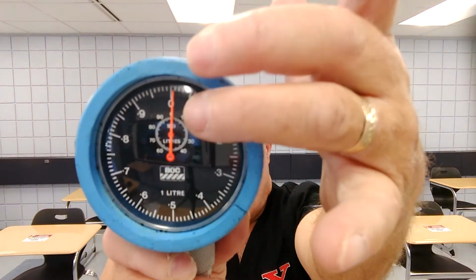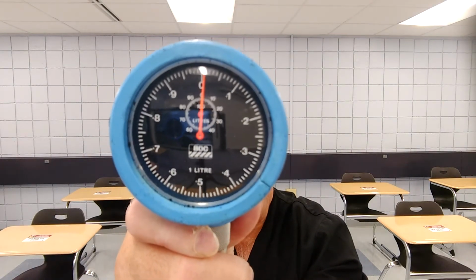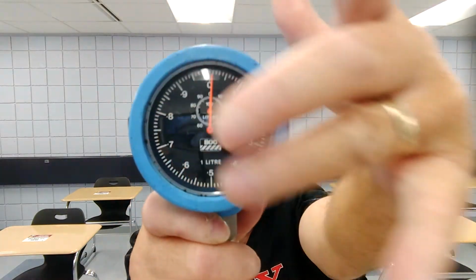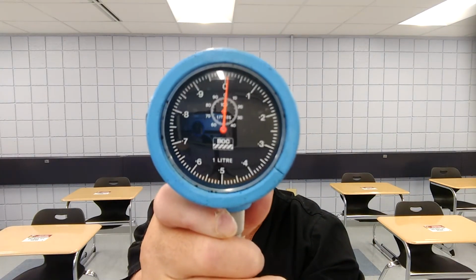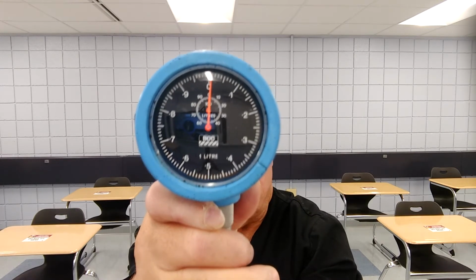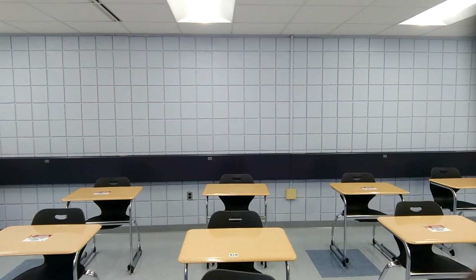The little scale up here that looks like a clock also has a needle that moves around, and each number on it stands for liters. So when this needle here goes all the way around once, the small needle will go to 1. That means the patient has exhaled 1 liter, or has 1 liter a minute ventilation. And we're going to show you how to read each one of these. They're all read the exact same way. This is one example of a respirometer.